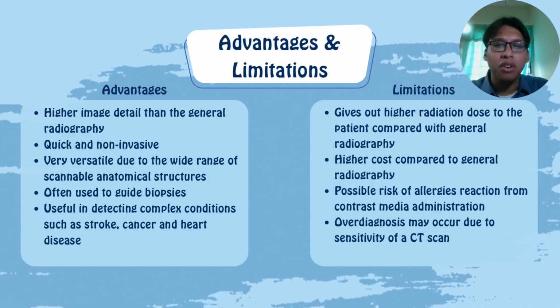But then, of course, with all those advantages, there are still some limitations that come with this machine. Well, first off, because it gives a higher image detail, it also gives a higher radiation dose to the patient compared with general radiography. And then it's also higher cost compared to general radiography, not just in terms of the purchase price itself, but also the maintenance cost is higher because you need to take care of not just the machine, but also the power injector that comes with the CT scan machine.